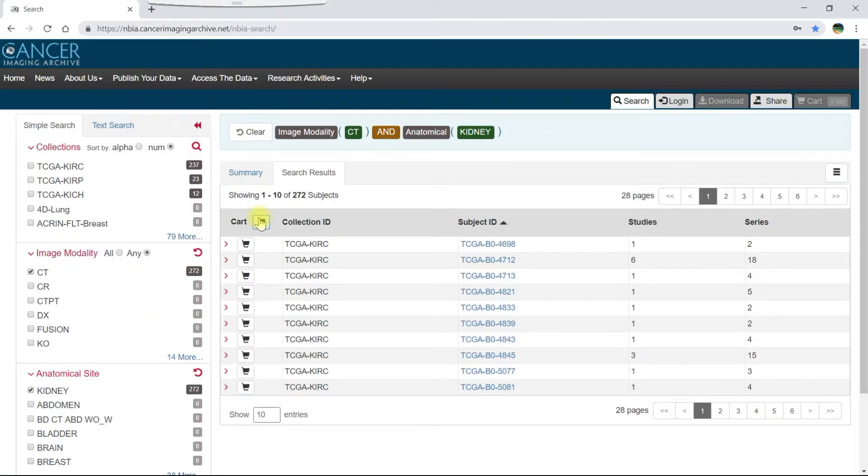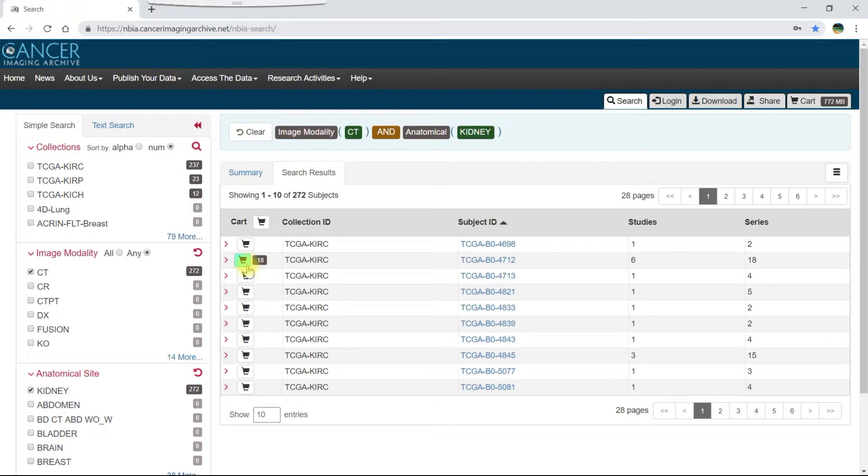Similarly, to restrict your selection to all data for a single subject, click the cart icon for that subject. It turns green, which shows that all data available for that subject are in your cart.